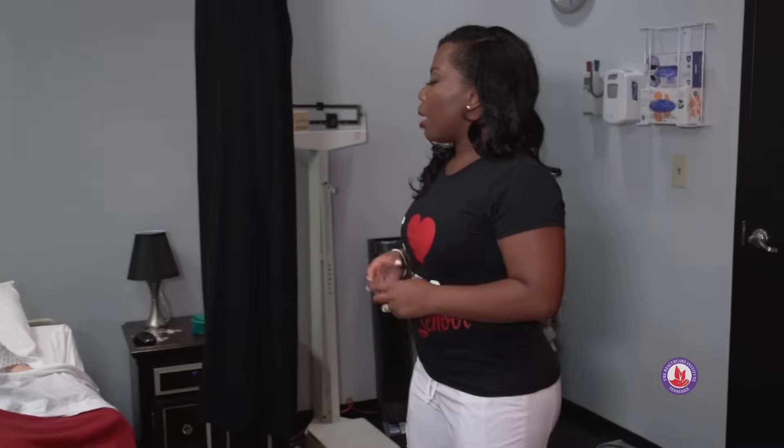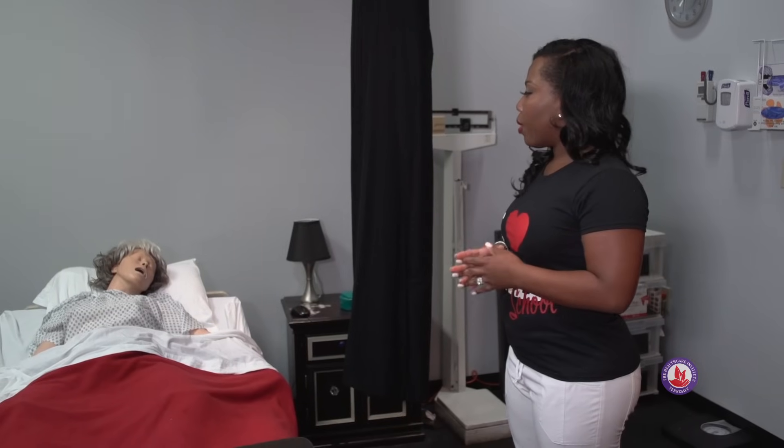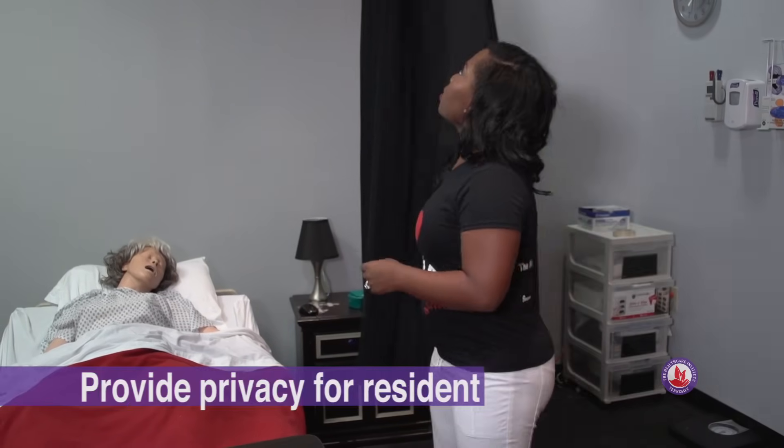Good morning, Ms. Dolly. My name is Katrina. I'm your nursing assistant today. I'm going to empty your urinary drainage bag, but before I do that, let me wash my hands and I'm going to provide you some privacy.